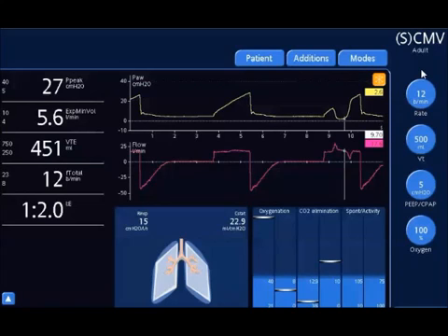minute ventilation demand in volume control ventilation. It usually results in flow mismatch, which is a flow asynchrony. And what the practitioner has to do, to meet this demand, is either increase the tidal volume or increase the inspiratory flow. So most likely they're going to increase the inspiratory flow. We have a lot to play with here. I have a flow rate of under 25. I can turn this flow rate up by directly turning up my flow if you have a flow setting, or decreasing my inspiratory time. However, we're going to get higher peak airway pressures with that.